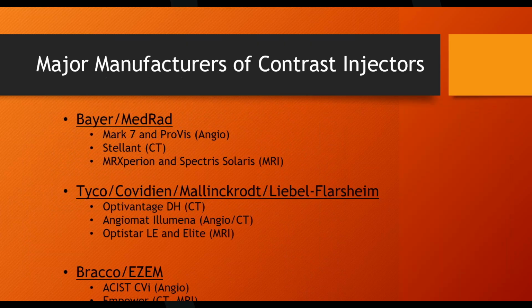Now, when it comes to contrast injectors, here in the United States there are three dogs in this fight, and there's an absolute pecking order amongst the three. The biggest company by far used to be called MedRad. A lot of people still refer to them as MedRad, but it's been about 6 to 7 years since they got bought out by a company called Bayer. Bayer makes the aspirin and stuff. They're by far the biggest manufacturer of contrast injectors. Probably 90% of all contrast injectors in the United States are Bayer MedRad injectors.